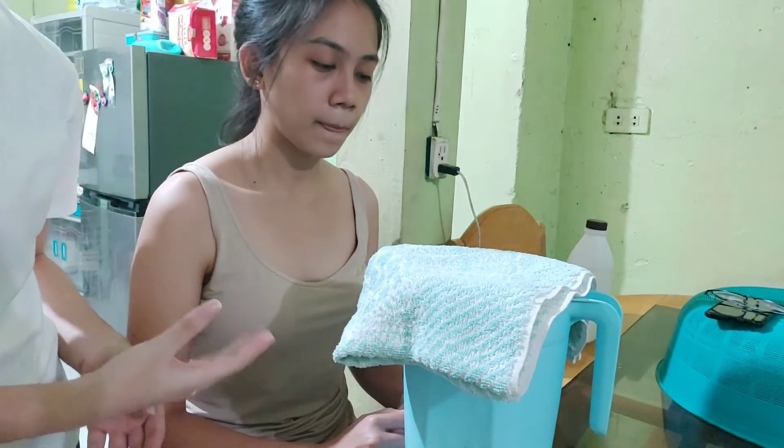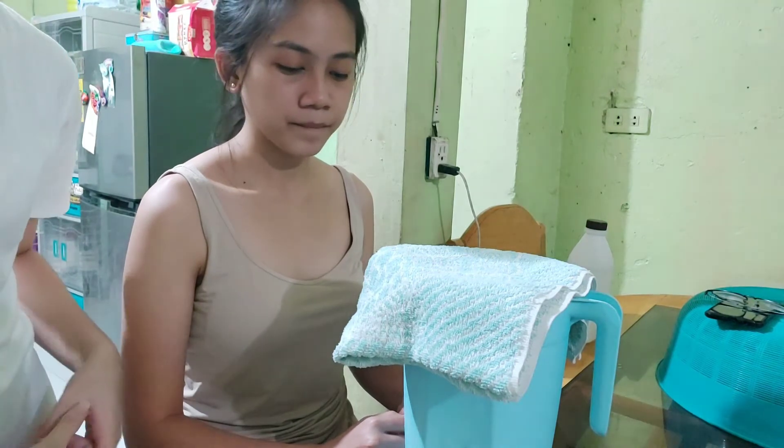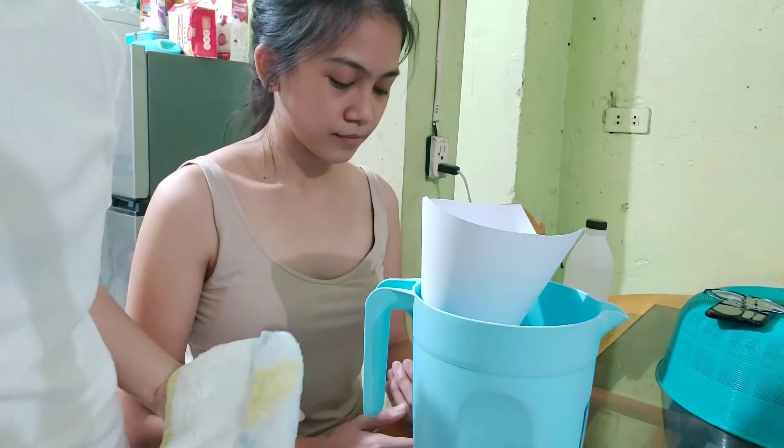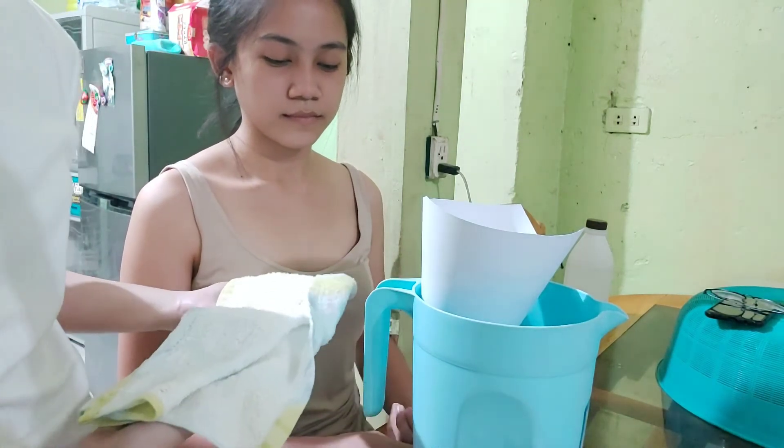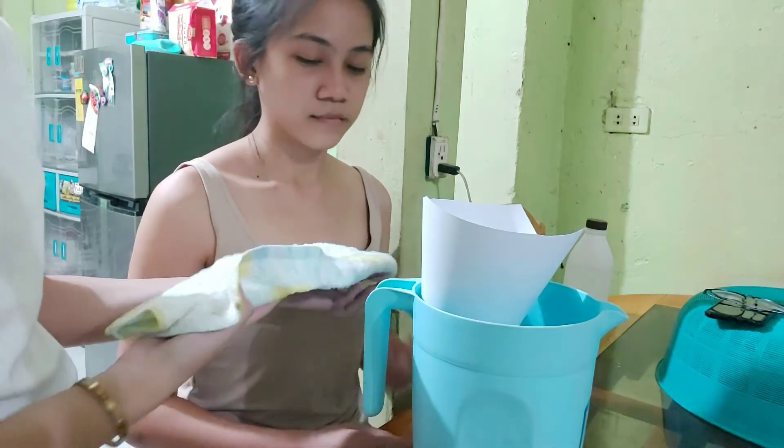After that, I will then have my patient sit on a high chair. I will now have the patient cover both of her eyes with a face towel to avoid acute eye irritation and burning sensations to the patient.